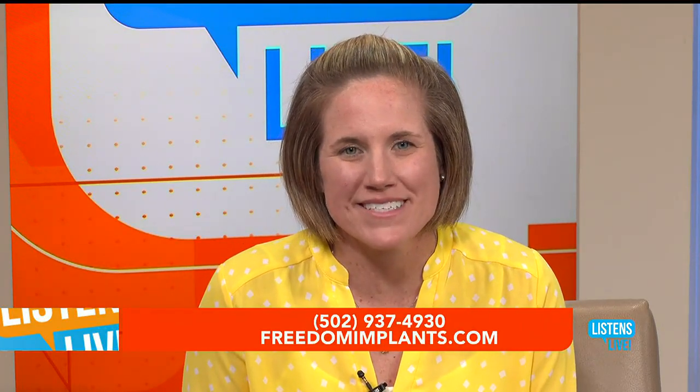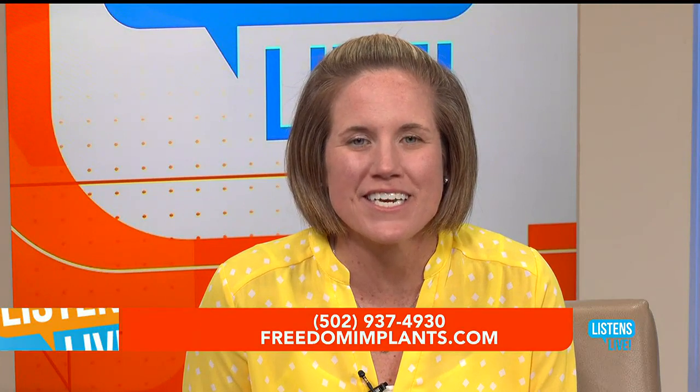But yes, I definitely could use the mini dental implants to replace 2 teeth in your situation. I can do it for 1 tooth. I can do it for 3 teeth. You don't have to be missing all your teeth to replace teeth with the mini dental implants. The only thing is usually the tooth has to be missing or extracted for anywhere from 3 to 4 months, because we want to make sure the bone and the gum have healed up and we have a nice, good, solid foundation, a good bone to place the implant in. But yes, it can definitely replace 2 teeth.